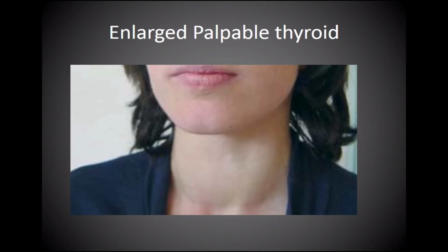Remember what we said at the beginning of this video. It's not recommended to scan generally without an indication like a palpable thyroid nodule, as you will find nodules in a large number of the general population. If we biopsy or do an FNA on all thyroid nodules, there'll be a lot of surgical procedures done on folks who do not necessarily need those procedures. Okay, so this is someone we should scan with a very enlarged palpable nodular thyroid.